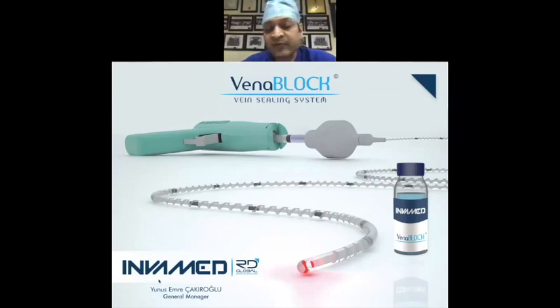The only drawback I feel is there is a constituent which delays the polymerization in the Medtronic glue. We feel that may be the cause of the granulomas. More than 10 studies have been published with Medtronic glue causing a granuloma in the skin, and a lot of people are afraid of putting a foreign body into the vein. We have done more than 150 patients with Invamed glue in the last 3 years, and we haven't seen a single patient with granuloma or complications.